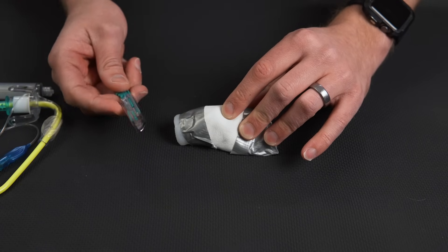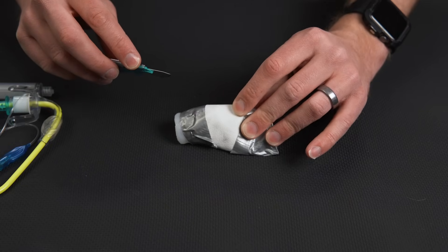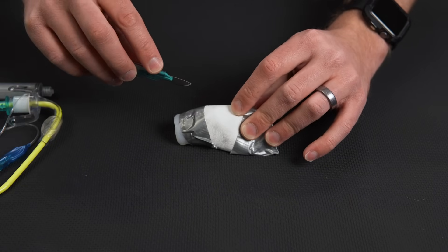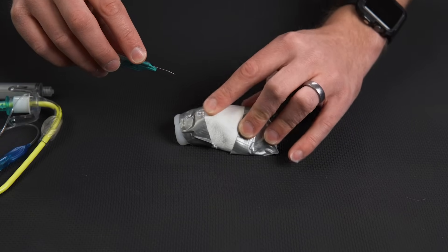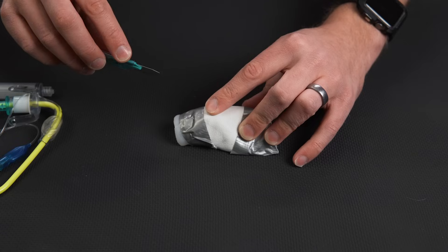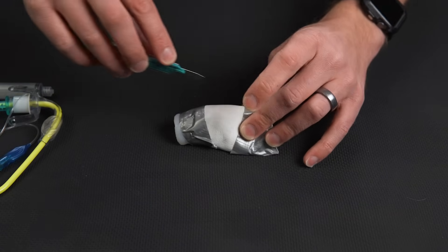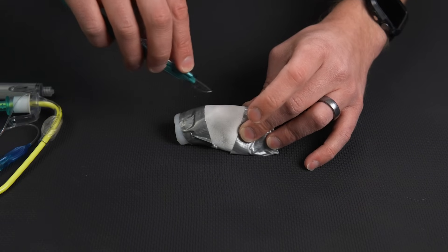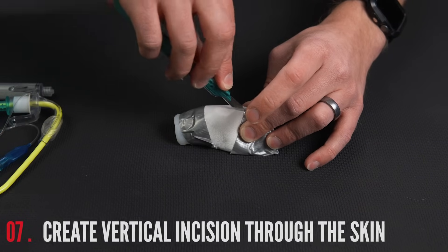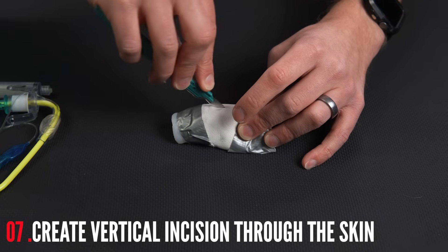I've got my scalpel here. This is the traditional technique. You can take the scalpel and the first thing we're going to do is start just above that membrane and we're going to do a vertical incision through the skin, but not all the way to the membrane. We're not going through the membrane yet. So this is not painting. I'm not going to do a bunch of strokes. We're going to cut down.